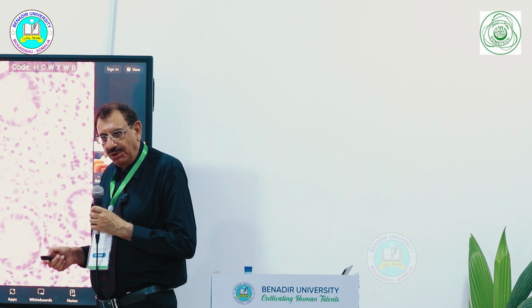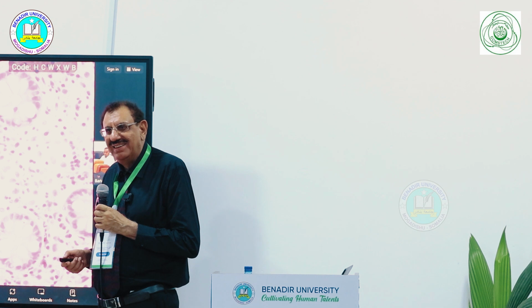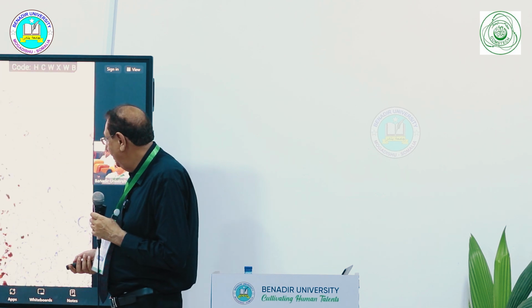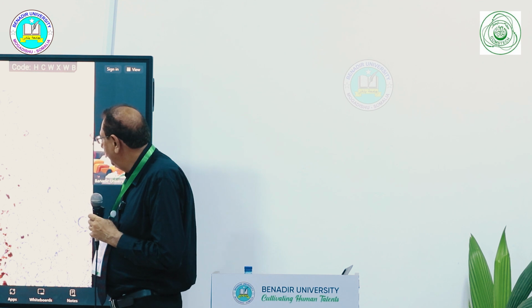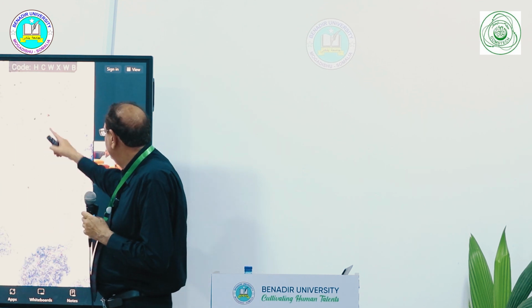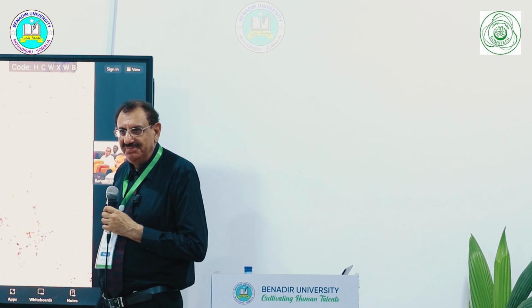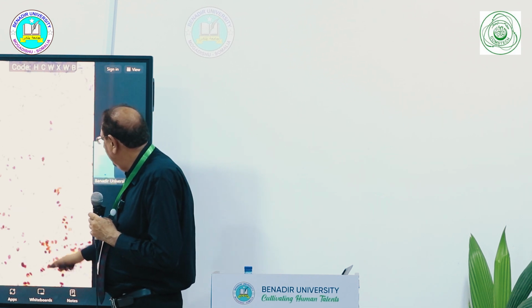We are talking about breast. Metastatic lobular carcinoma. That's cytokeratin 7, BRST, estrogen receptor, higher magnification.